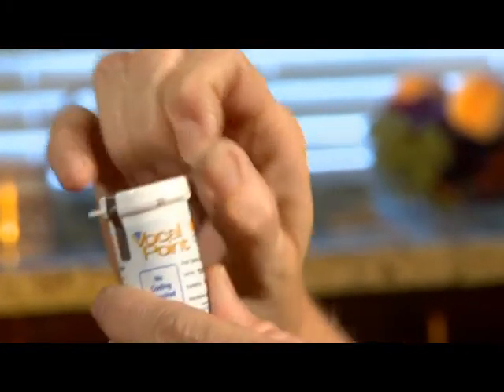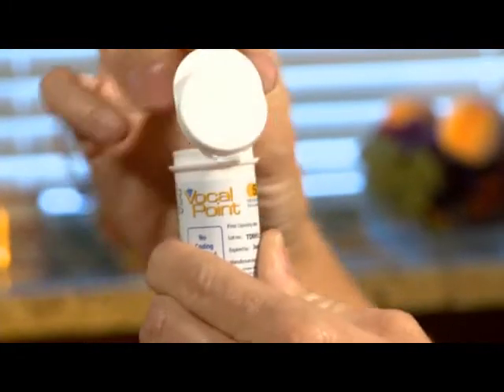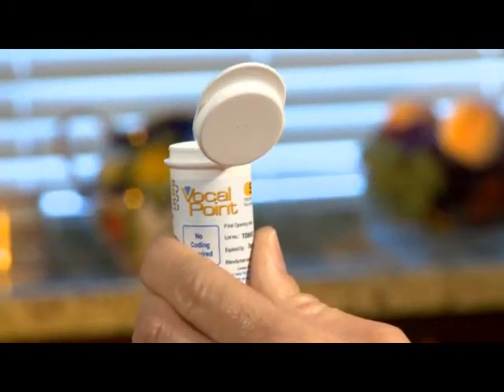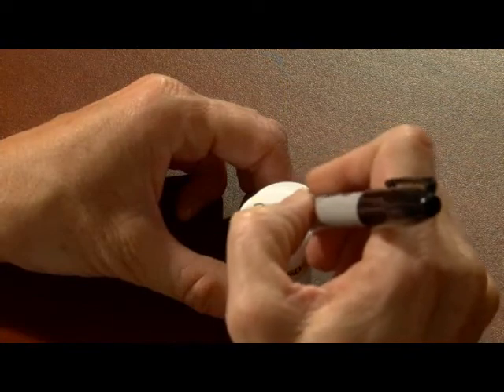First, open a vial of test strips by removing the tamper seal and opening the cap. Please remember, once they're opened, the test strips have an open vial shelf life of 90 days. It's recommended that you write the date on the vial when it's opened.